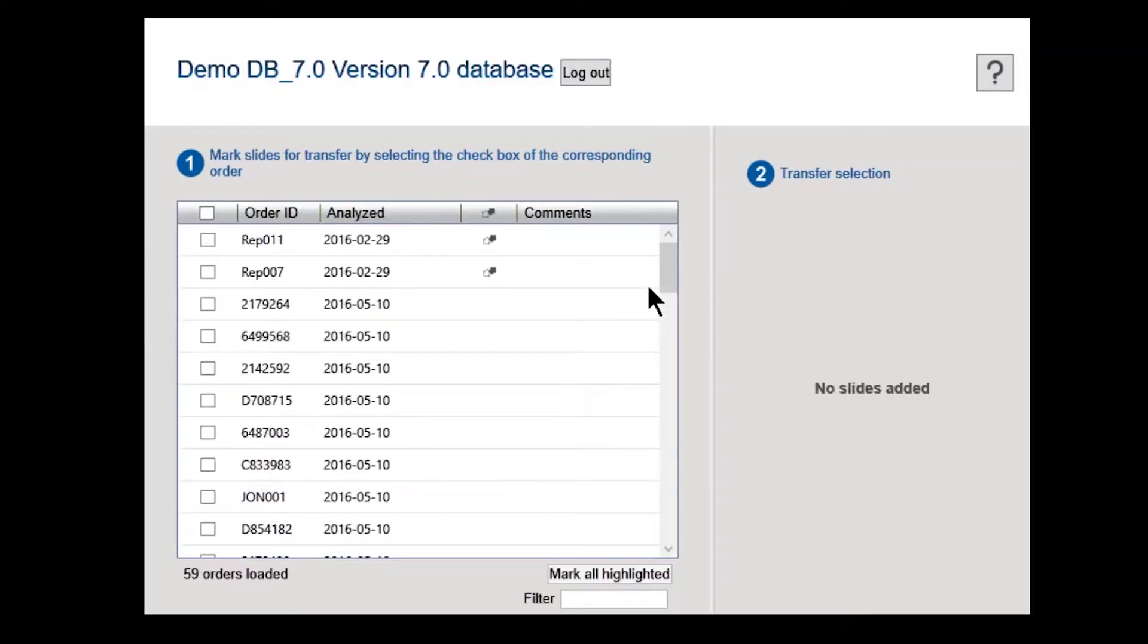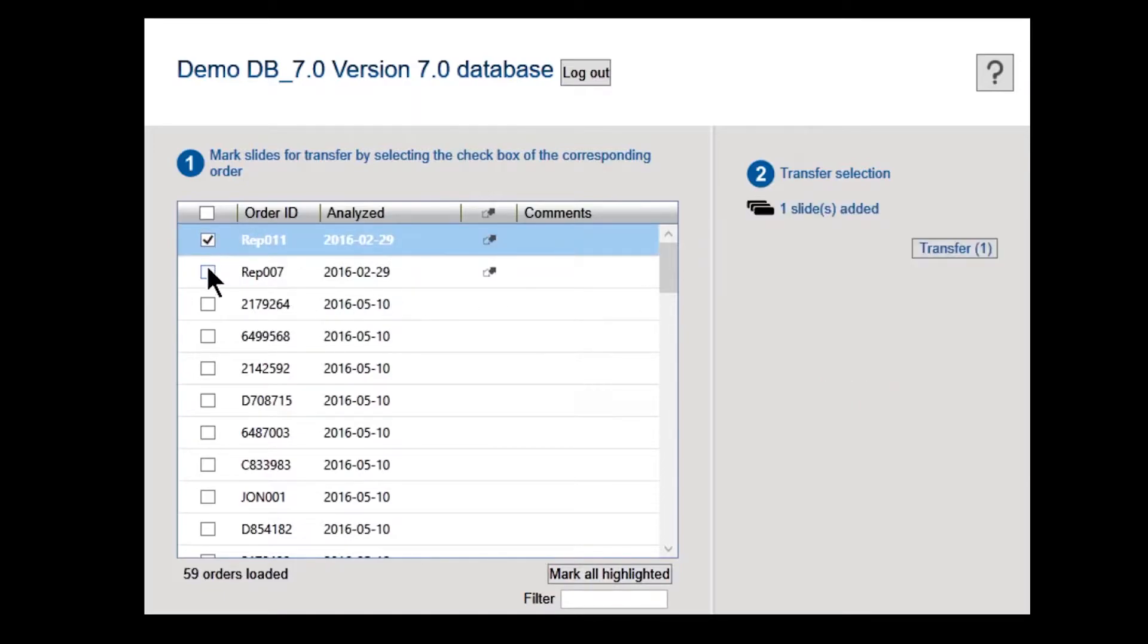The table shows a list of all available slides in that database. Note that slides are also referred to as orders in other CellVision software.